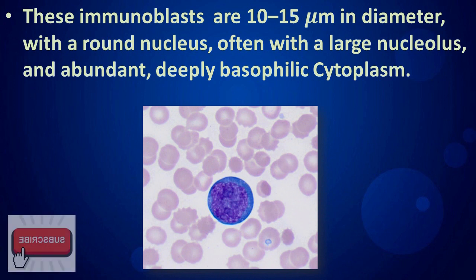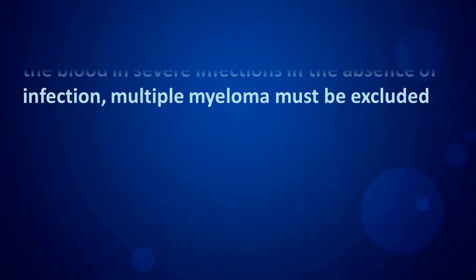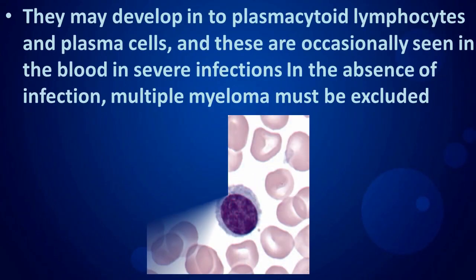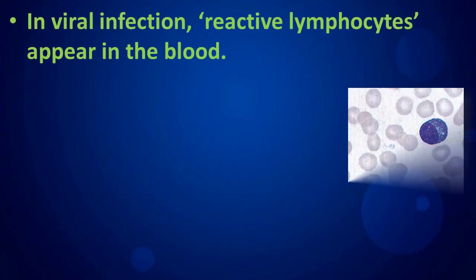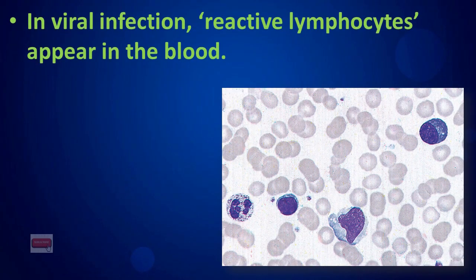These immunoblasts are 10 to 15 micrometers in diameter, with a round nucleus, often with a large nucleolus, and abundant deeply basophilic cytoplasm. They may develop into plasmacytoid lymphocytes and plasma cells, which are occasionally seen in the blood in severe infections. In the absence of infection, multiple myeloma must be excluded. In viral infection, reactive lymphocytes appear in the blood.